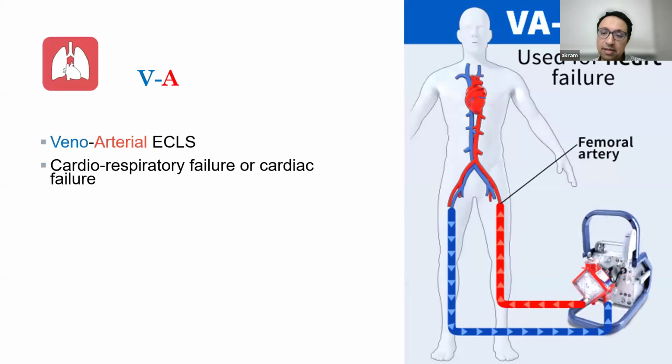If the heart is impaired, for example in severe cardiomyopathy, we need a pump to maintain hemodynamics, so we use ECMO as a pump. Of course, the blood is drained in the same way from the venous compartment using a pump, then crosses the membrane lung and is returned back into the femoral artery, where it shares in the cardiac output, bypassing the heart and the lungs. So this mode is used for support of cardiac patients.